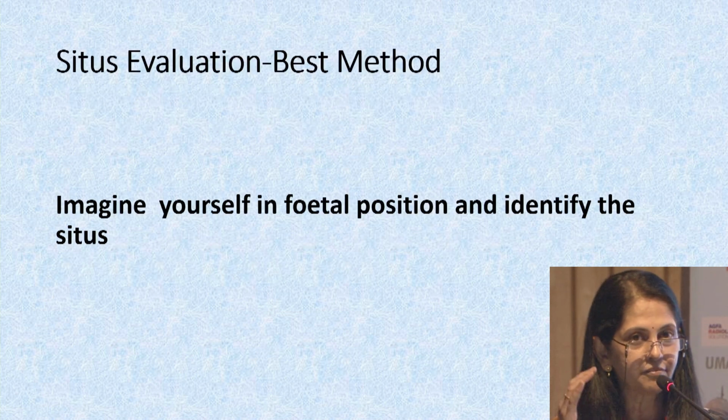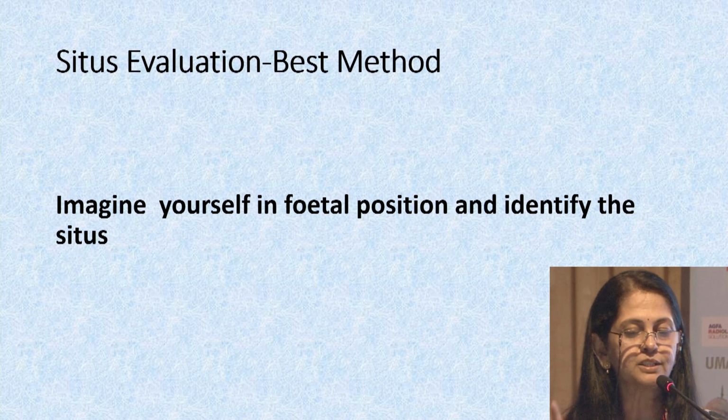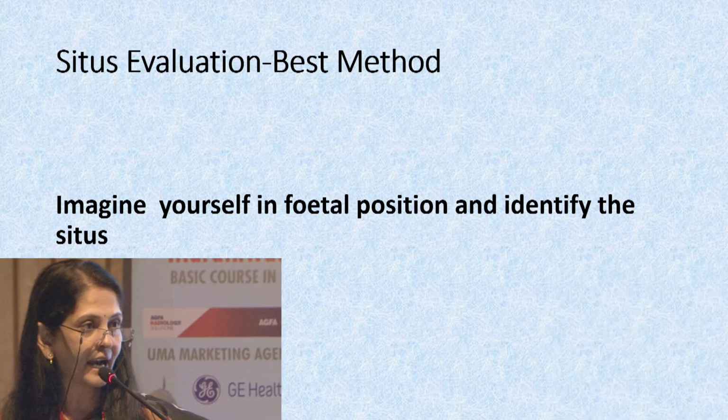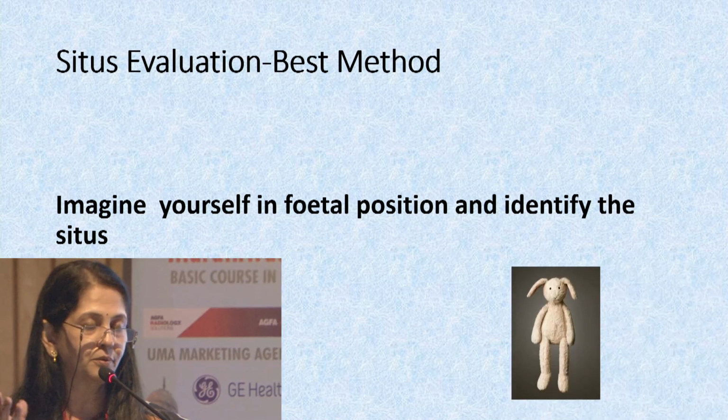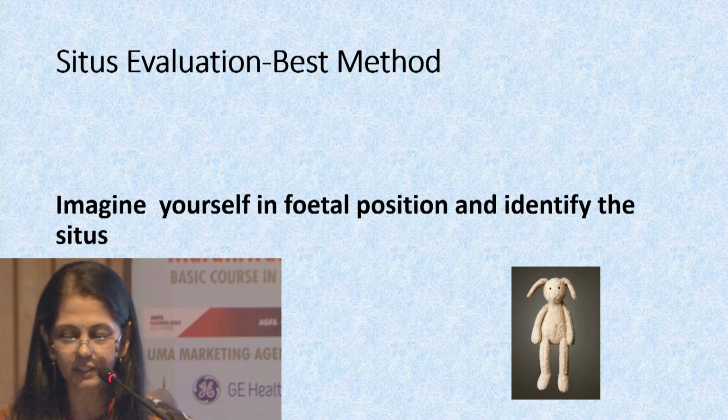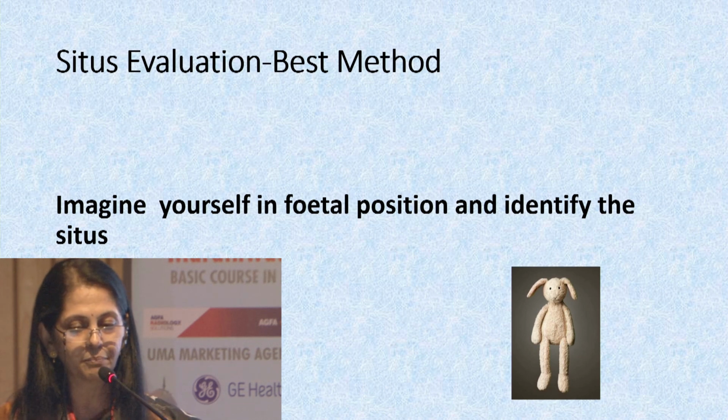And for any fetal examination, the beginning is with the evaluation of the situs. There are multiple methods, but the best is to imagine yourself in the fetal position. And if you are not able to do that, you can keep a teddy with you, with a neutral gender teddy, so that the PNDT people will not trap you.